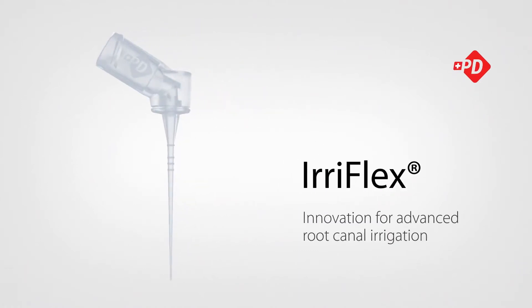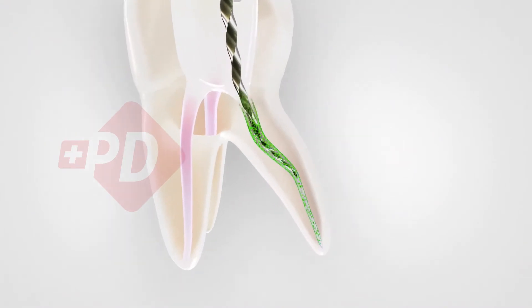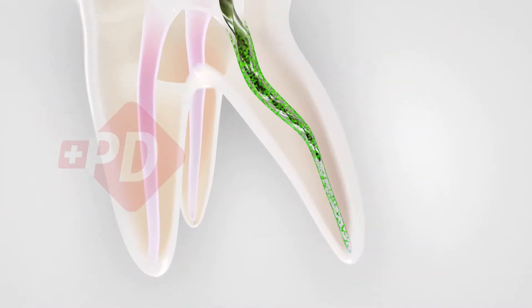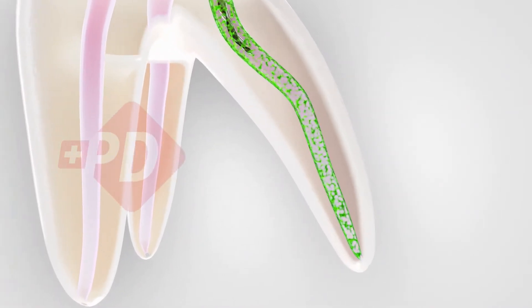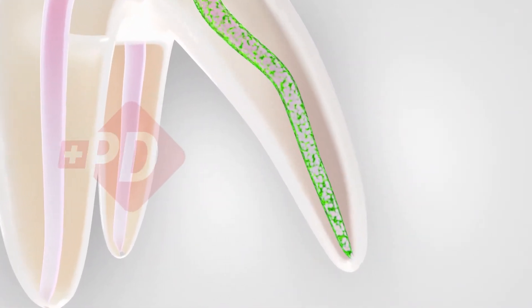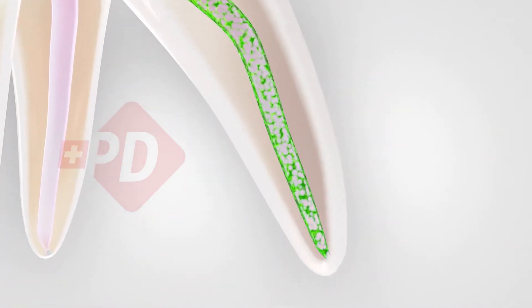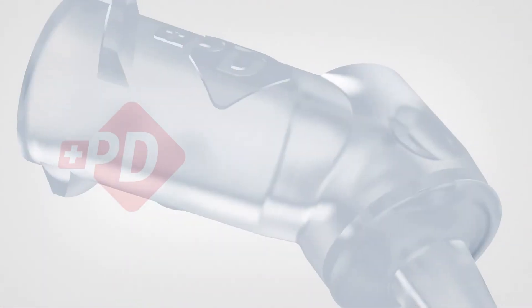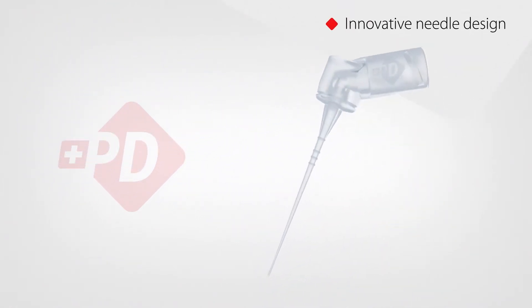IrriFlex: innovation for advanced root canal irrigation. Instrumentation of the root canal during endodontic treatment produces a smear layer which covers the root canal walls. Residues of debris, smear layer, and biofilm can lead to apical periodontitis. IrriFlex is an innovative dental irrigation needle designed to improve cleaning and disinfection procedures.